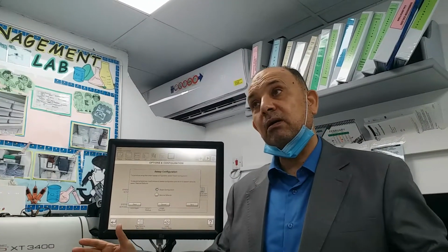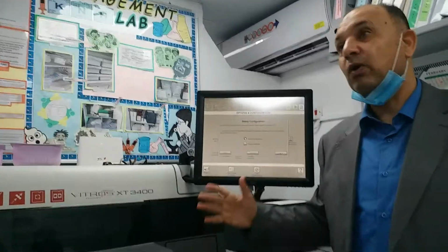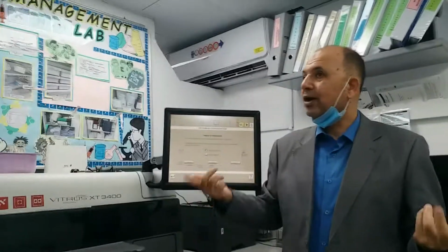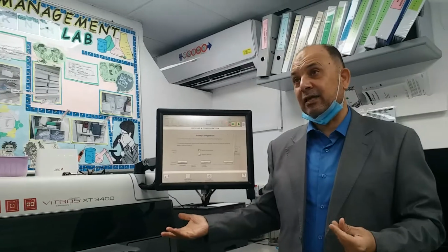If I open the AMR, why? Suppose your patient sample should be read up to 300, and you open the AMR to 400. If your patient is more than 300, it will read, while it should not read. It should make a dilution, and the dilution will give you a better result. Why? Because I can exceed the limit if the sample is still reading. I have no problem. But what is your problem if it's read?